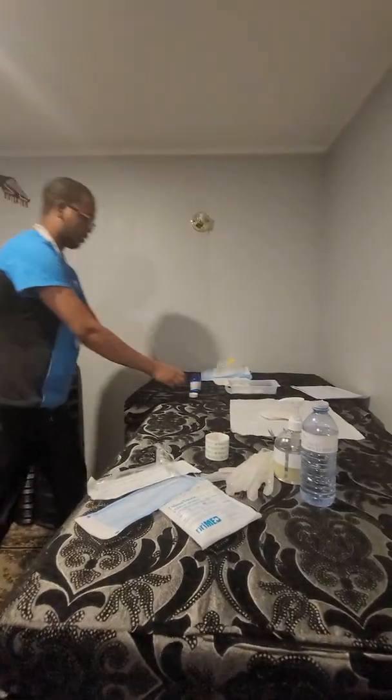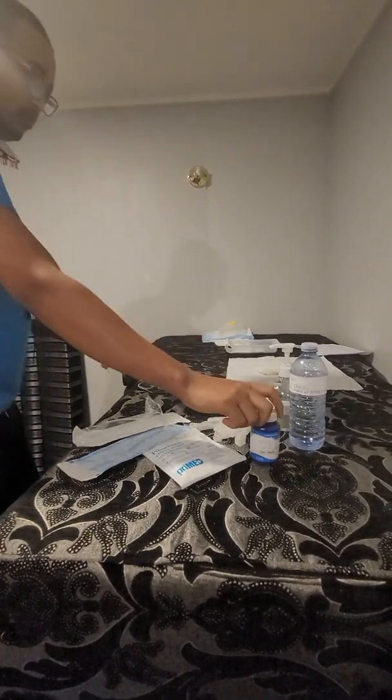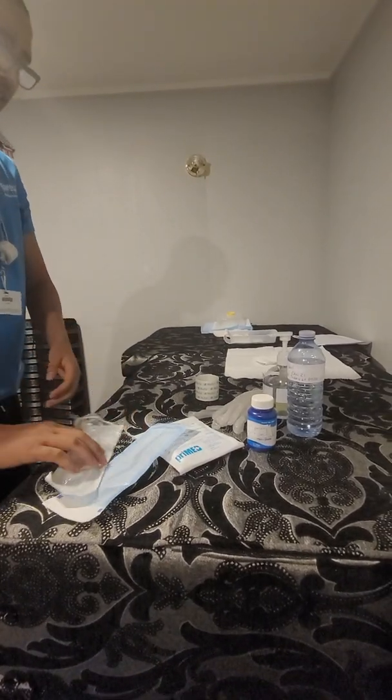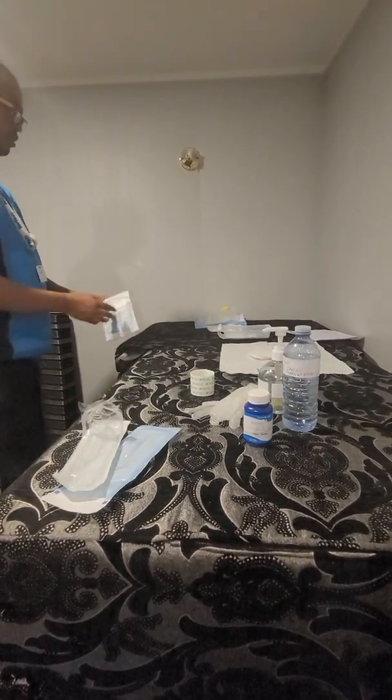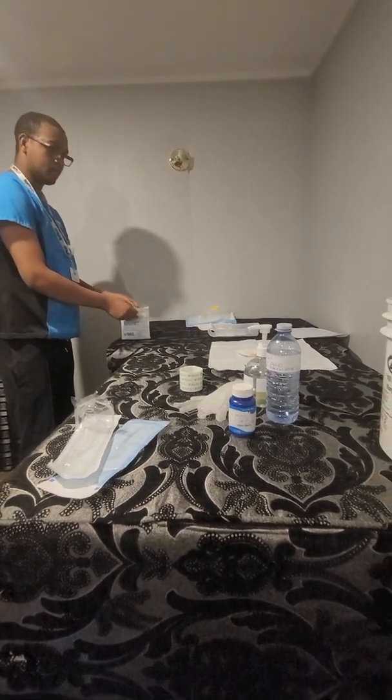Okay, close this one. Then now I can put on my sterile glove and then start cleaning.